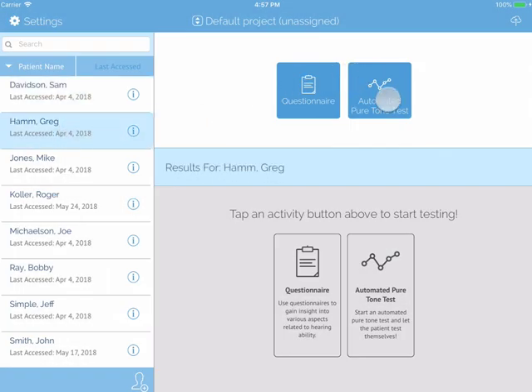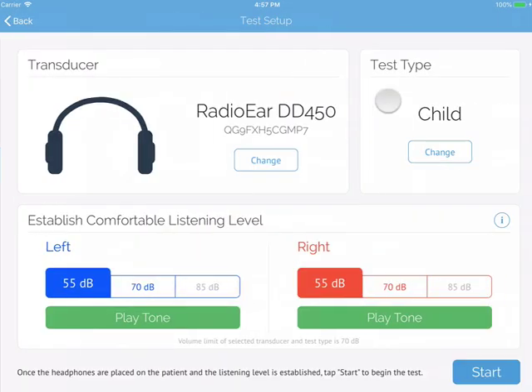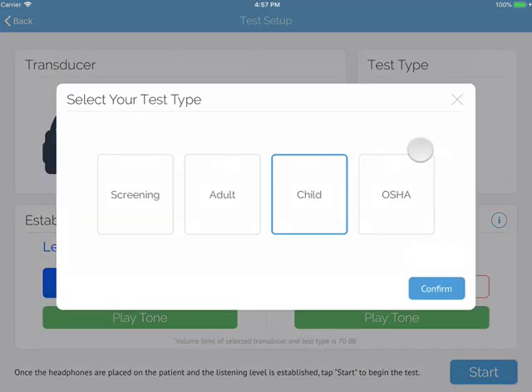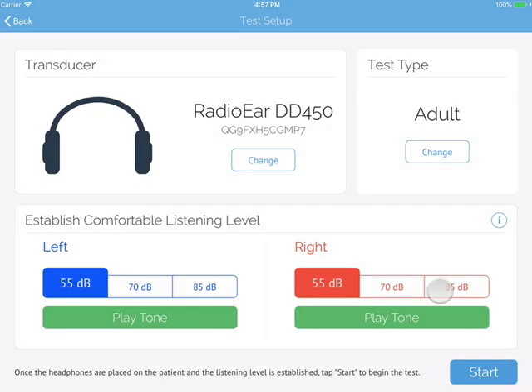With your patient selected on the top left, tap on Automated Pure Tone Test. This will prompt the Test Setup screen. Select your transducers and then your test type with the change buttons.